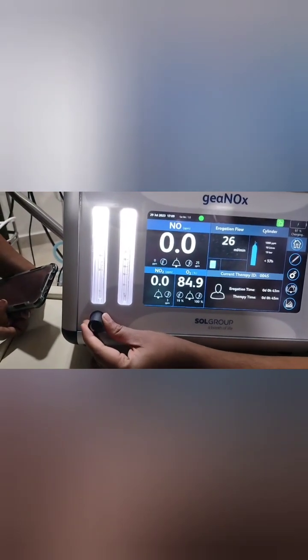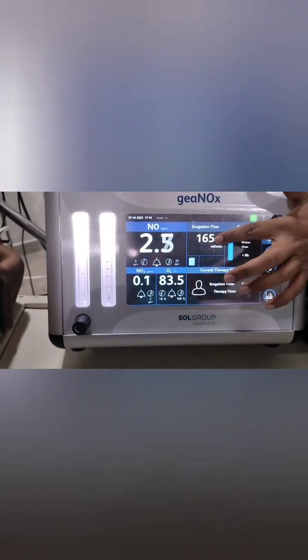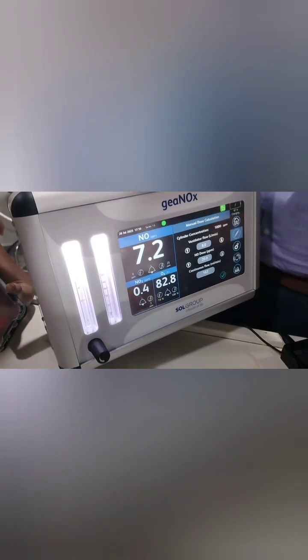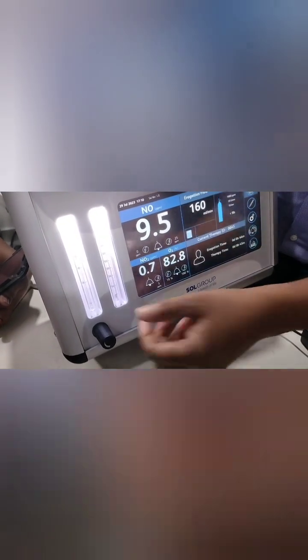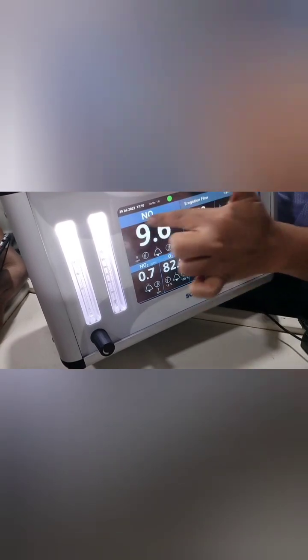There is an increase and a decrease knob — one for fine adjustment and one for coarse adjustment. For example, I set it to 120, then adjusted further up. The flows are decided by your ventilator flow and how much ppm you want to deliver. For conventional ventilation, the flow may be around 8 LPM; for HFO it is more, around 15 to 16. You enter those values and the calculator gives you the required iNO flow — for example, 160 mL/min.